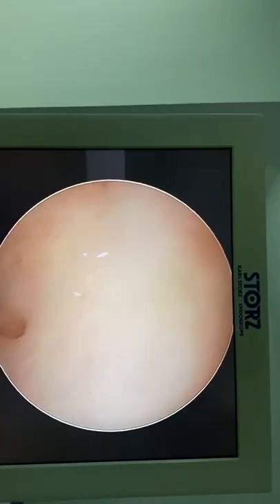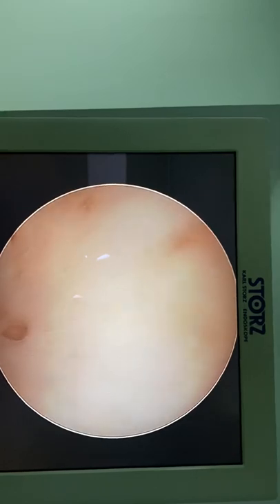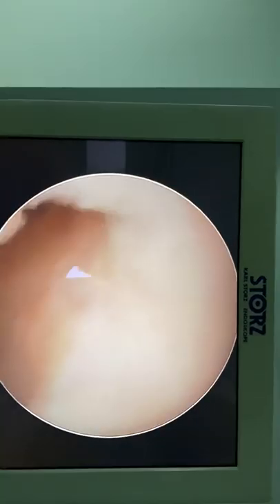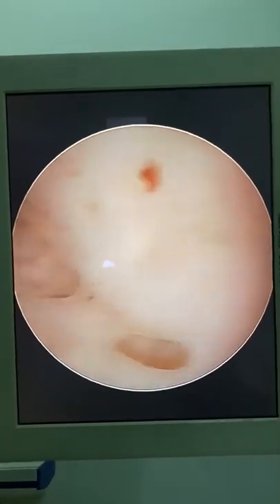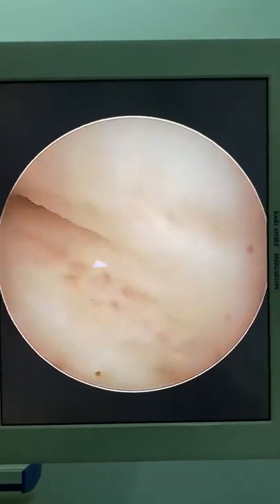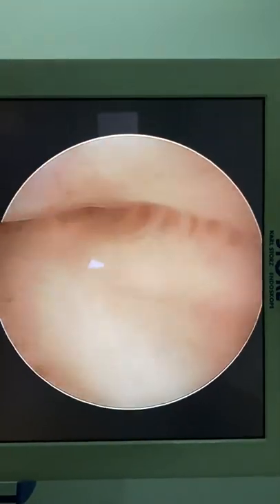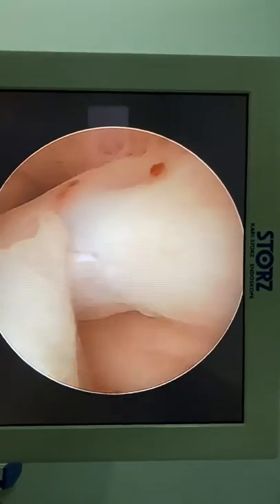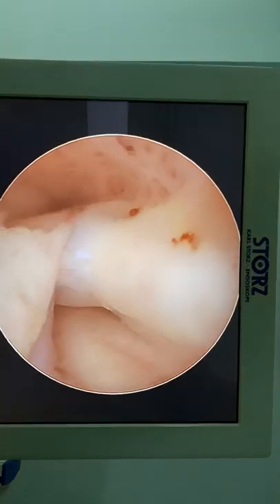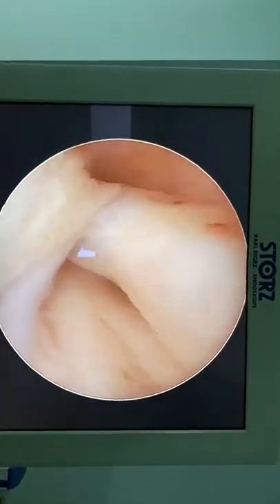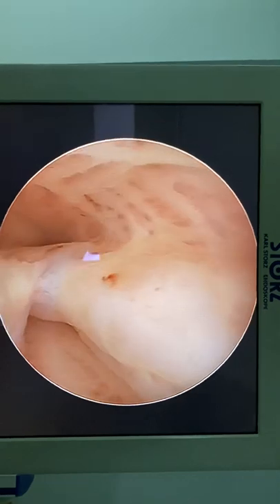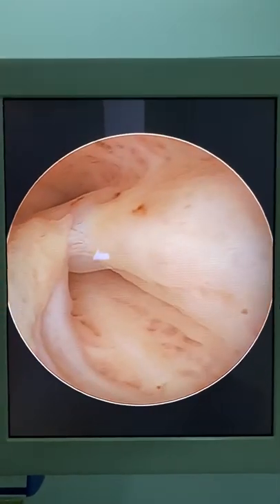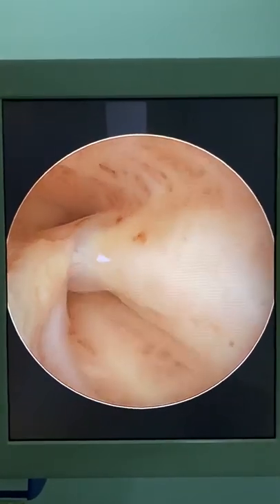This is the transformation zone — the squamo-columnar junction, the zone between the stratified squamous epithelium and the columnar epithelium. As I expected, the uterus is retroverted. And there is a septum — or it looks like adhesions. Okay, so a perfectly formed structure — septum or adhesions.